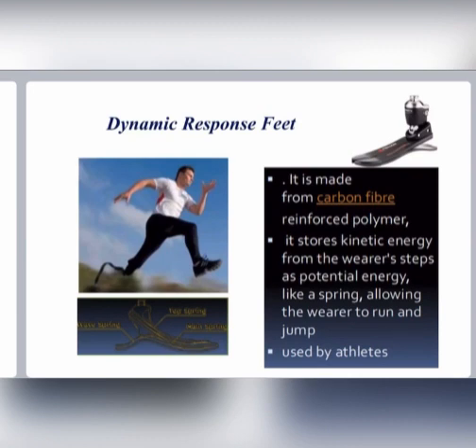Dynamic response feet. It is made of carbon fiber reinforced polymer. It stores kinetic energy from the wearer's steps as potential energy like a spring, allowing the wearer to run and jump, and is used by athletes. Thank you.